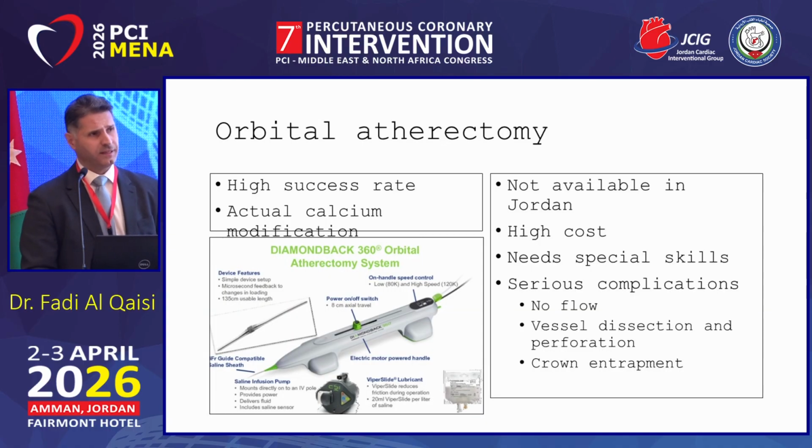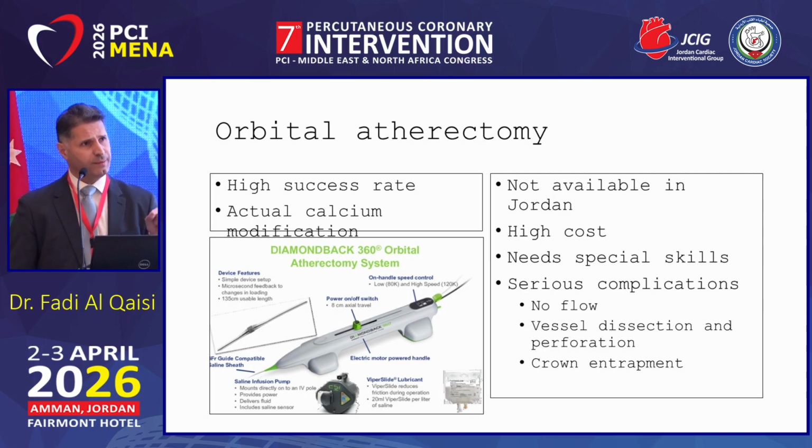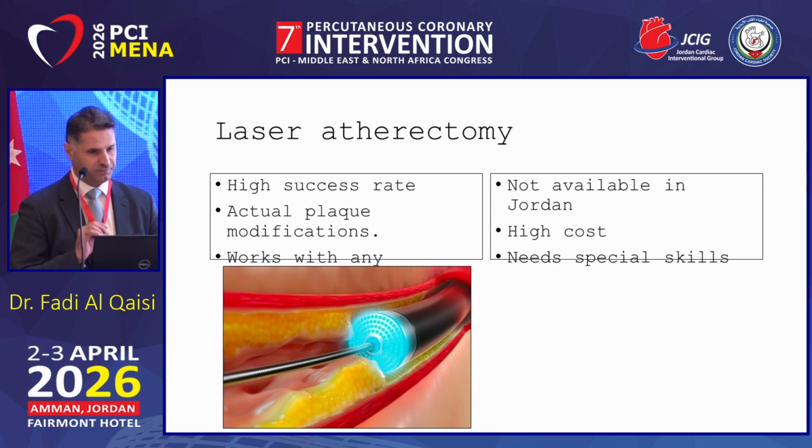Orbital atherectomy has a very high success rate. Again, it provides actual calcium modification. They are not available yet in Jordan, but there are people trying to bring it. It has a high cost, the same thing, it needs previous preparations and special skills, and likewise it has high complications: no reflow, dissection, perforation.